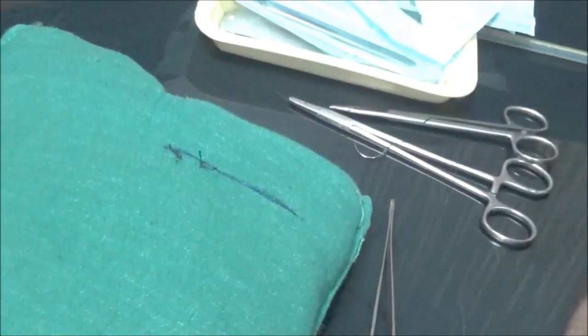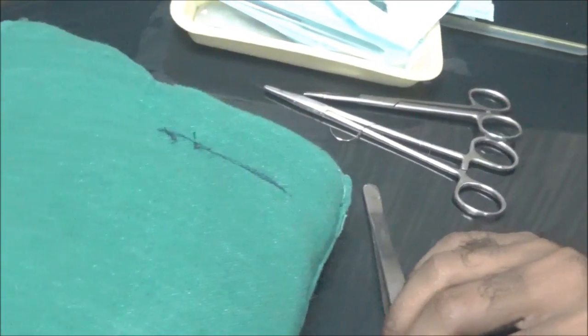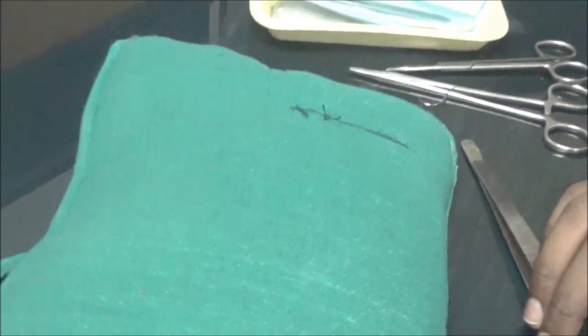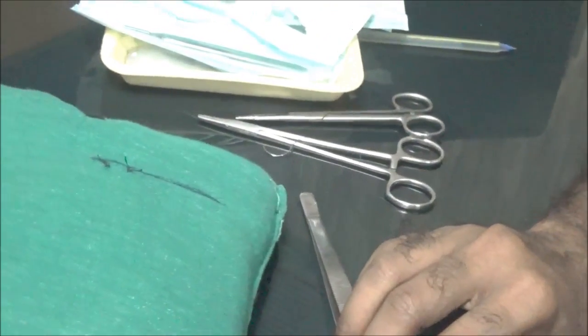Practice on pillows — do 50, 100, 150 sutures. Practice with open eyes, then with closed eyes.